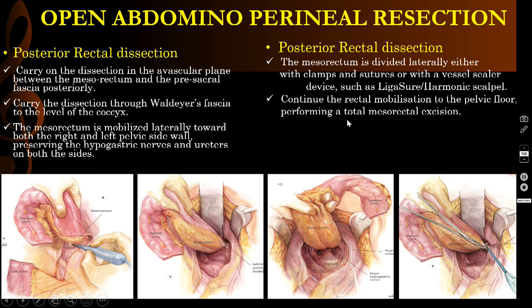Okay, we have to continue this rectal mobilization to the pelvic floor level, and while doing this you have to perform the total mesorectal excision. So mesorectum also you have to remove along with the rectum.